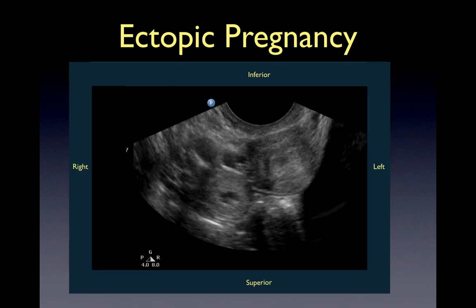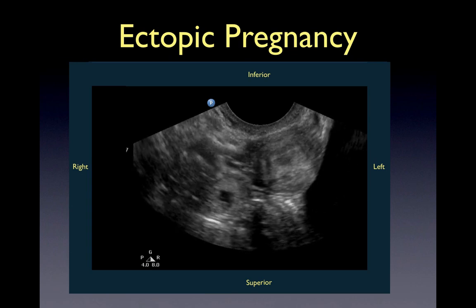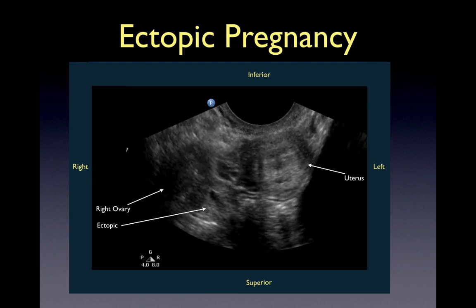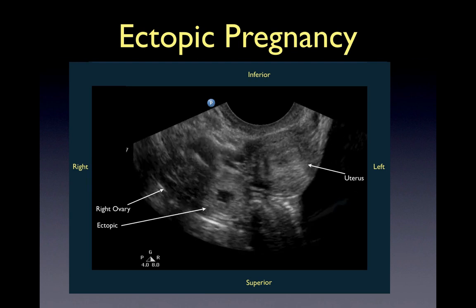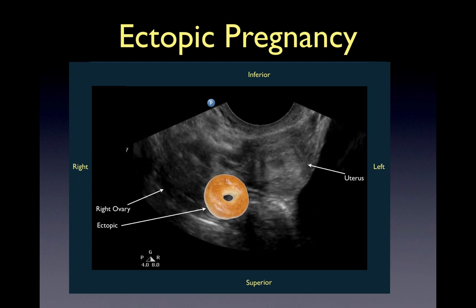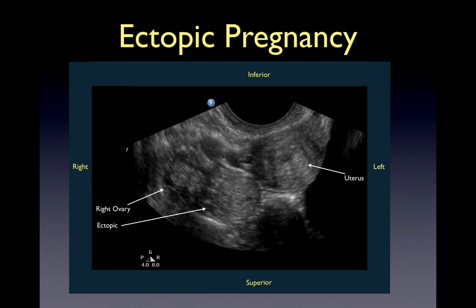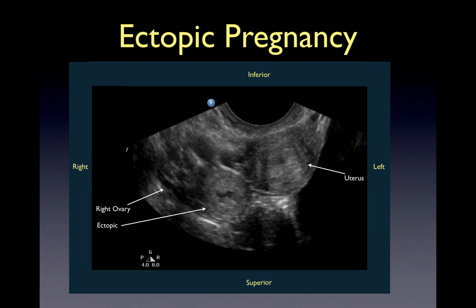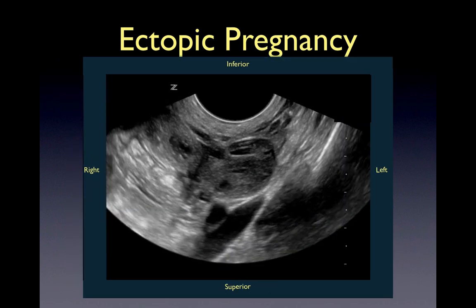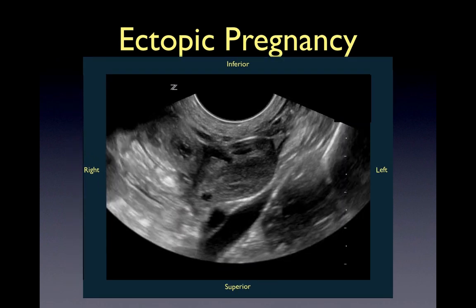A major advantage of transvaginal ultrasound is the earlier gestational age at which the diagnosis of an ectopic can be made. An intact and well-defined tubal ring, commonly referred to as the bagel sign, is seen medial to the right ovary in this clip. While not evident here, you may see a yolk sac, fetal pole, and heartbeat within the tubal ring. A different patient, this clip depicts a tubal ring medial to the left ovary.